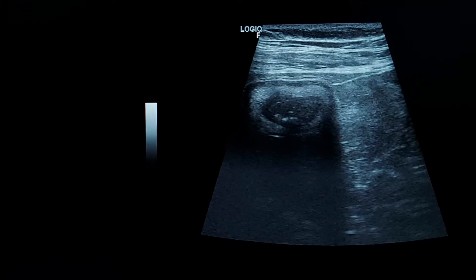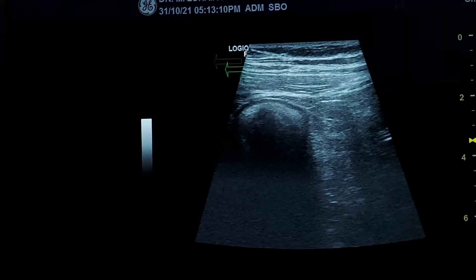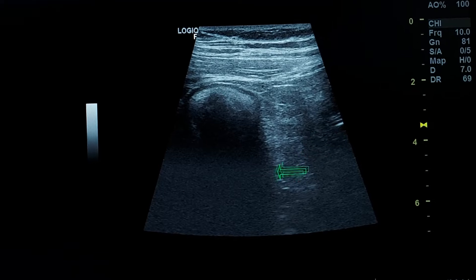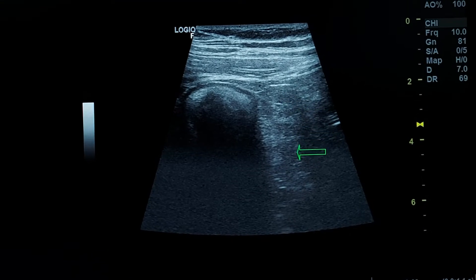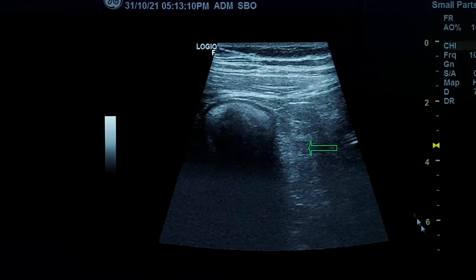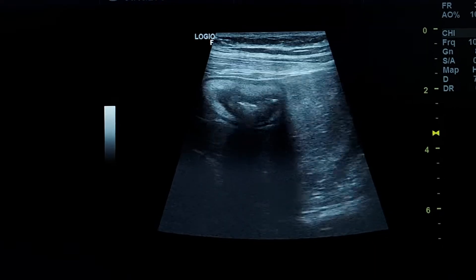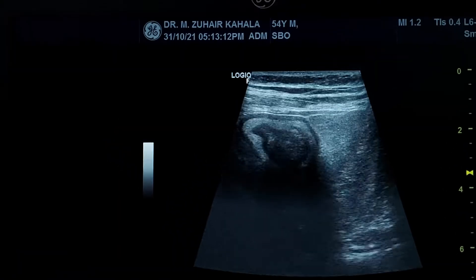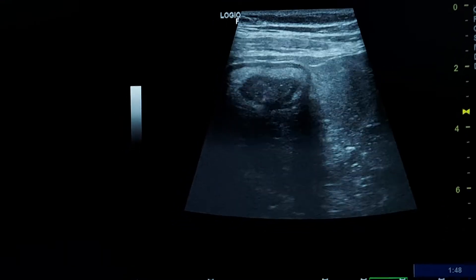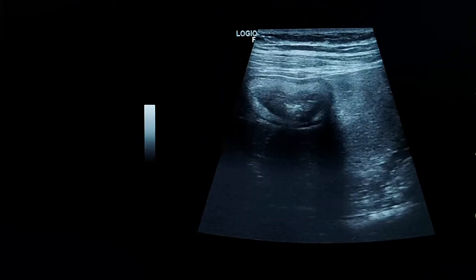the adjacent fat is echogenic. This was the transition point, and these are the dilated small bowel loops.